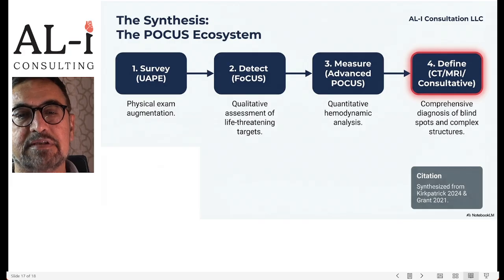The POCUS ecosystem is part of the whole cardiac ultrasound spectrum. Cardiac ultrasound works best when integrated with lung ultrasound, venous ultrasound, physical examination, hemodynamics, and the overall clinical picture. It is not a standalone trick. It's a bedside extension of reasoning.